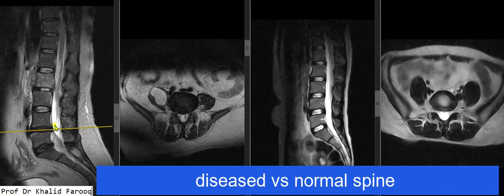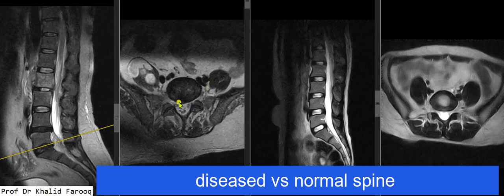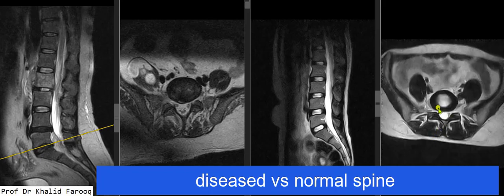Here we can see there is a small broad-based disc bulge at L4/5, which can be confirmed on axial images. There is also a tiny right paracentral disc bulge at L5/S1. Additionally, a radial tear is noted in the right posterolateral fibers of the annulus fibrosis, which leads to chemical neuritis of adjacent nerves and can cause significant pain. In the normal case, there is no such radial tear.